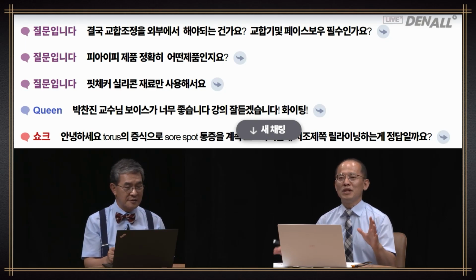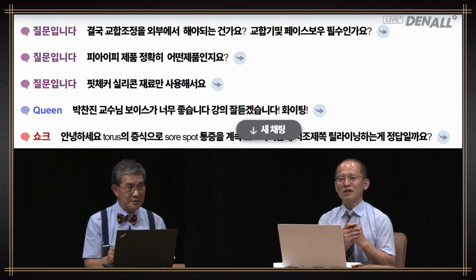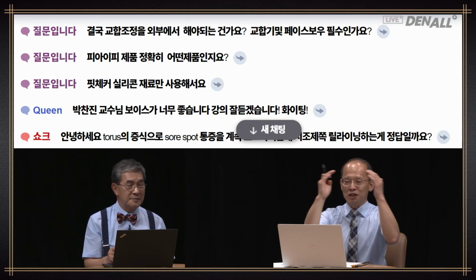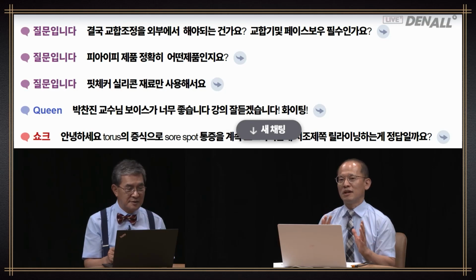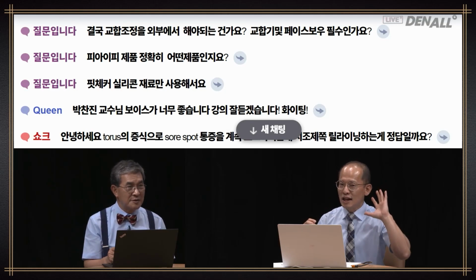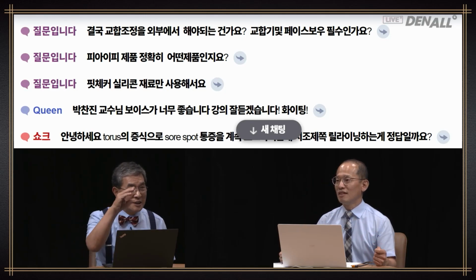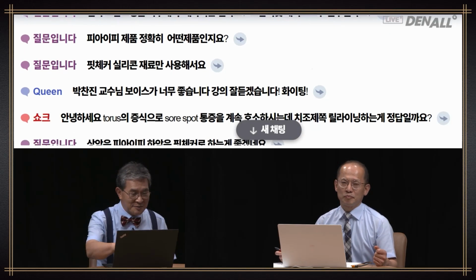You don't have to use a face bow. Mucosa does its work, and the patient can adjust. And you don't really need even a semi-adjustable articulator. In an articulator, what's most important is the size. You have to use at least head size rather than small sizes. If it's an average articulator, you have to use a big one. So not a small articulator, but a big one, at least your head size, okay?